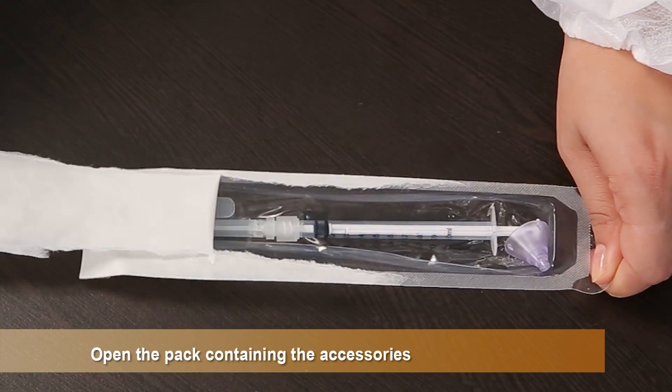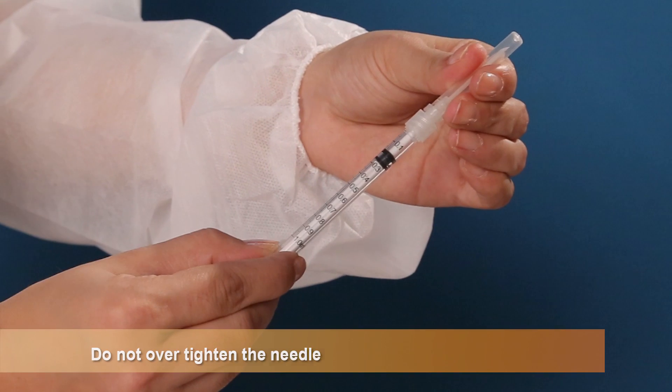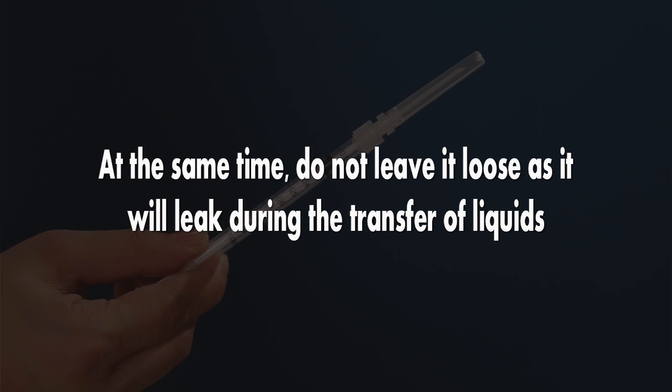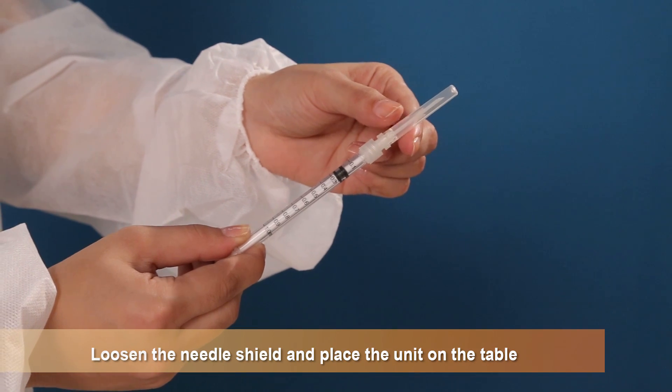Open the pack containing the accessories. Fix the needle on the syringe. Do not over-tighten the needle as this creates difficulty in removing the needle. At the same time, do not leave it loose as it will leak during the transfer of liquids. Loosen the needle shield and place the unit on the table.